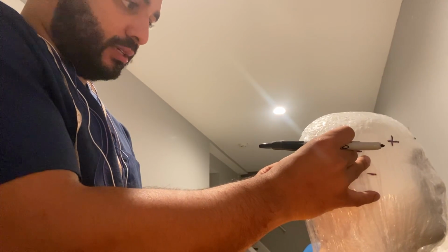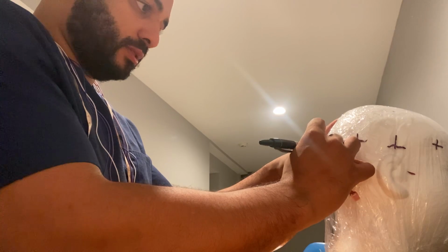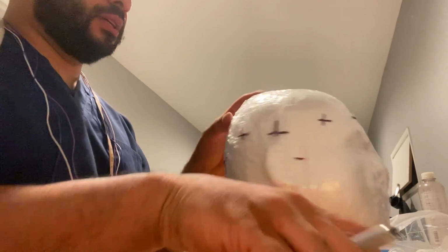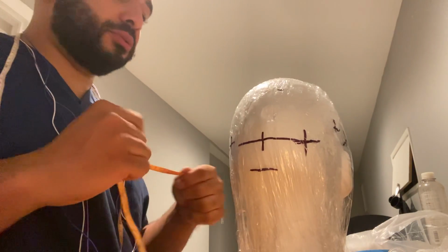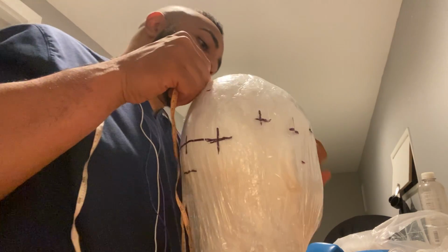And lastly, another 5/4 that matches up with this line. Circumference.